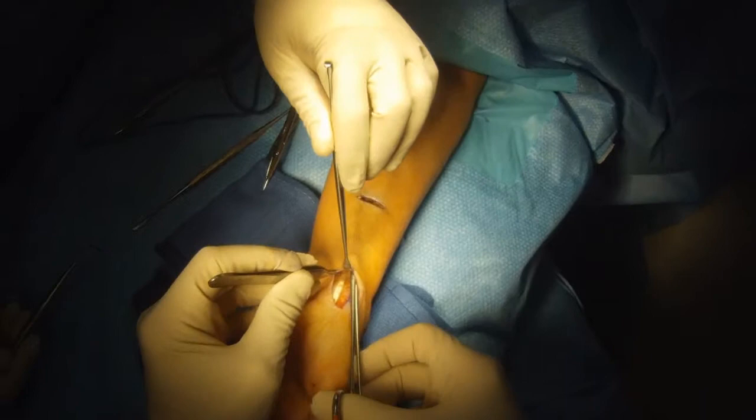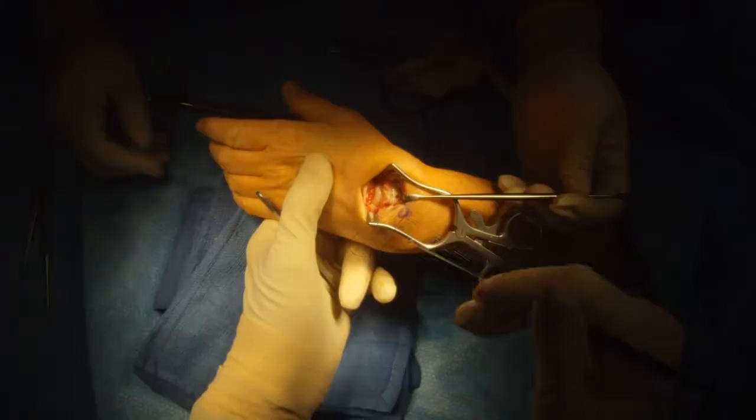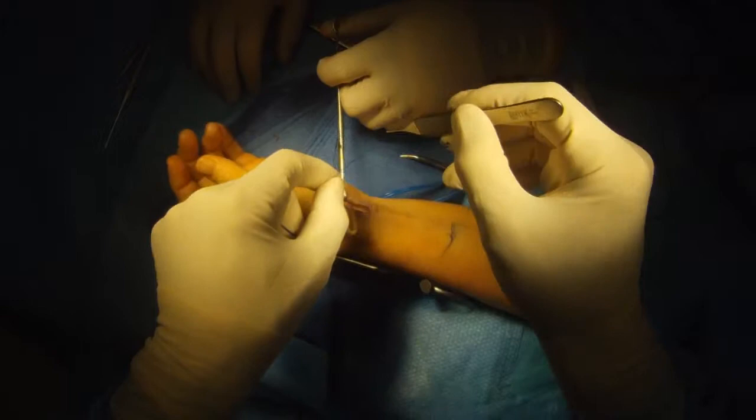Now we're going to pass the third of the tendon we harvested from the forearm to the wrist. Then we're going to pass it through the tunnel in the scaphoid from the front of the wrist to the back of the wrist, where we'll use it to reconstruct the scapholunate ligament.